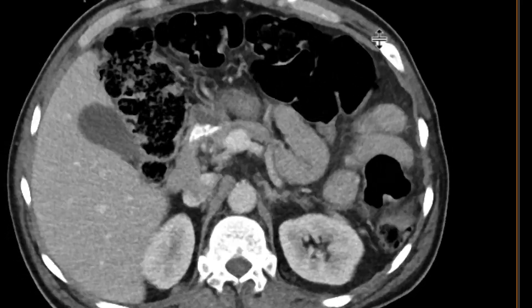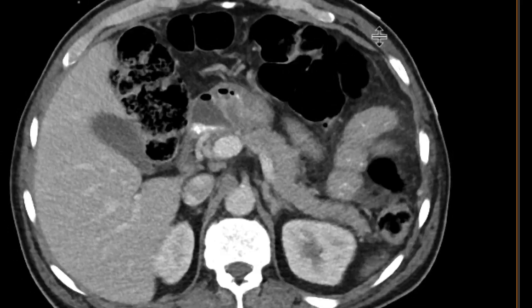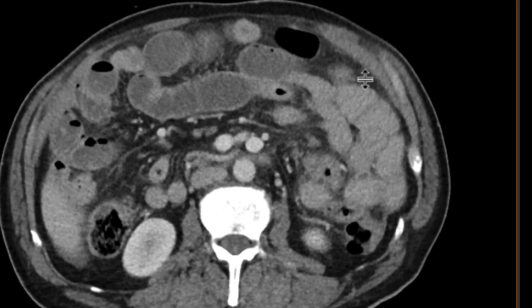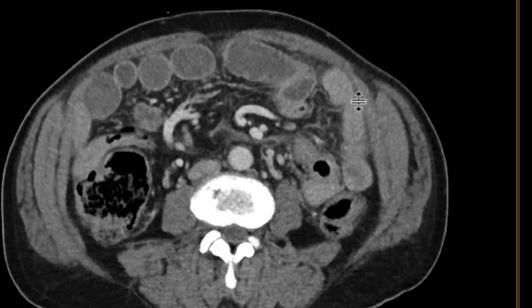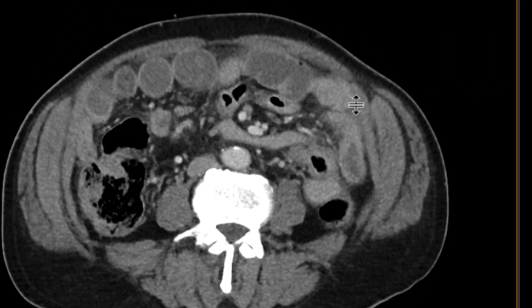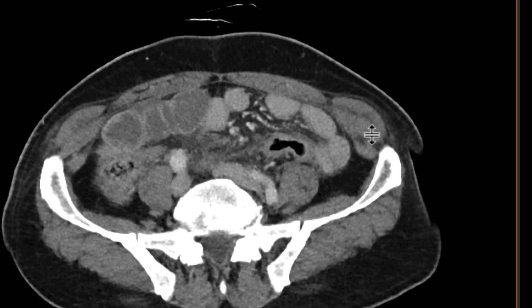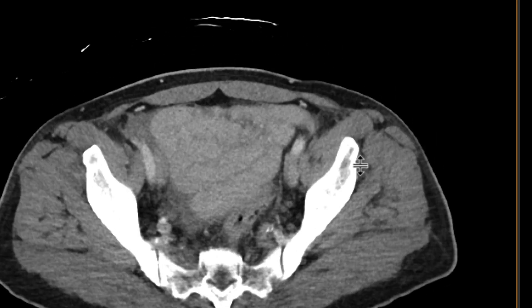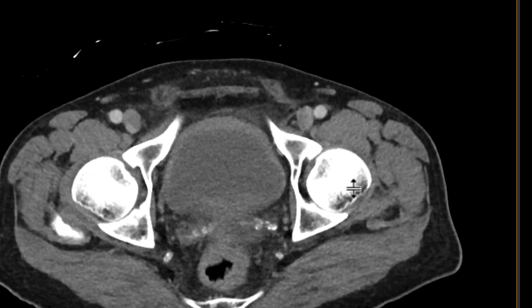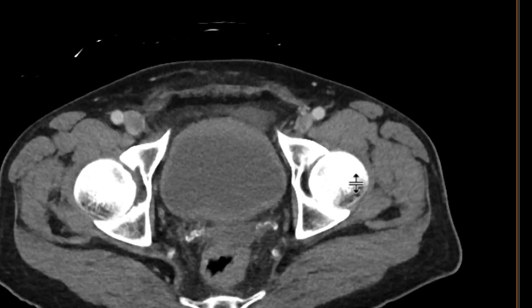We can check the organs in the upper abdomen — all of that looks within normal limits. We're going to focus on the bowel. We can see that there's a bunch of loops of bowel that are fluid-filled and somewhat distended, so there may be some sort of process going on in the bowel.